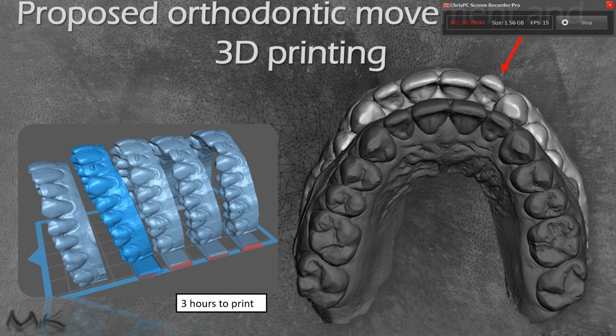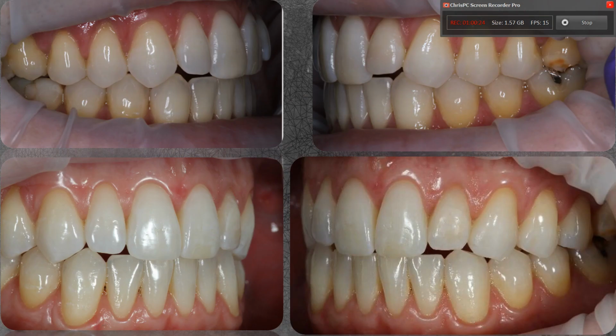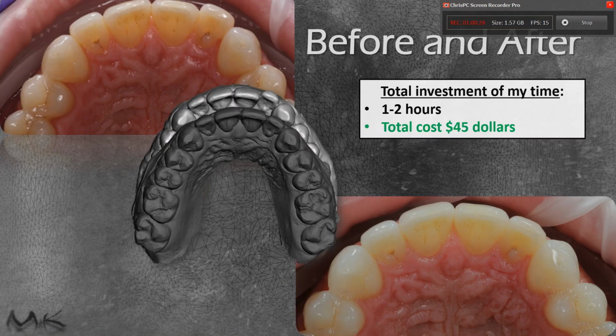It was about 3 hours of printing. And you can see before and after. Very straightforward. The patient was thrilled with this limited orthodontic movement, and it was overall very simple to achieve. So when we look at this, it took about 1 to 2 hours of my time and cost me about $45. I'm not going to talk about what you would charge your patient for something like this. I'll let you decide that for your own practice.